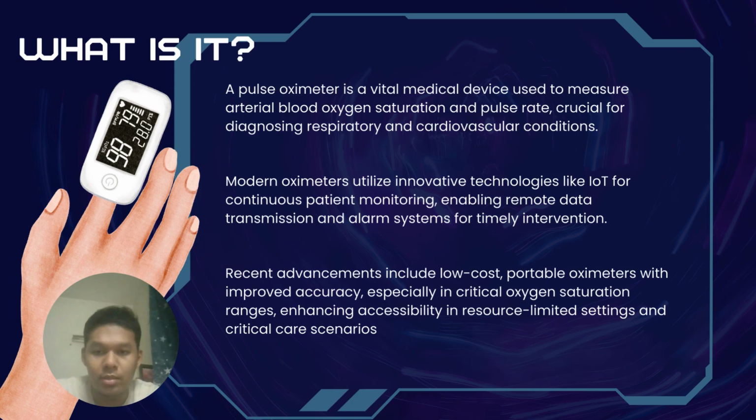Recent technologies include low-cost, portable oximeters with improved accuracy, especially in the critical oxygen saturation range. Also, it enhances accessibility in resource-limited settings and critical care scenarios.